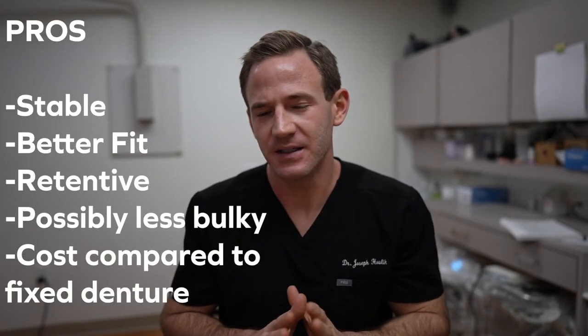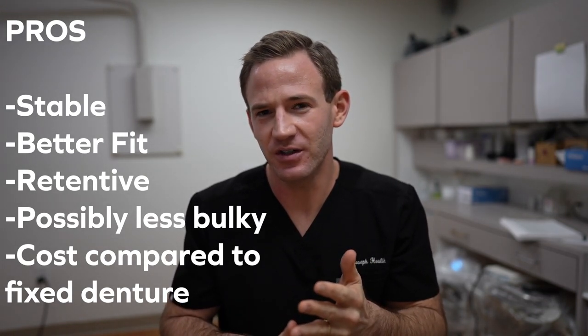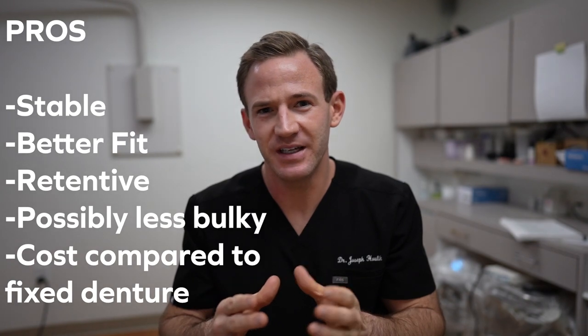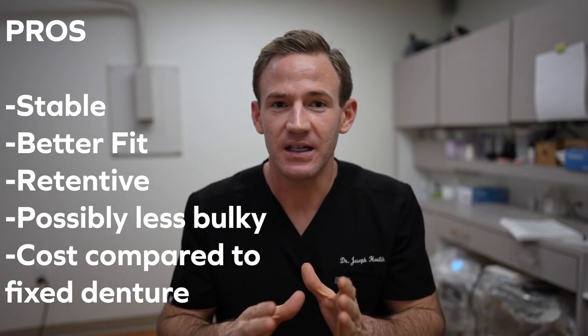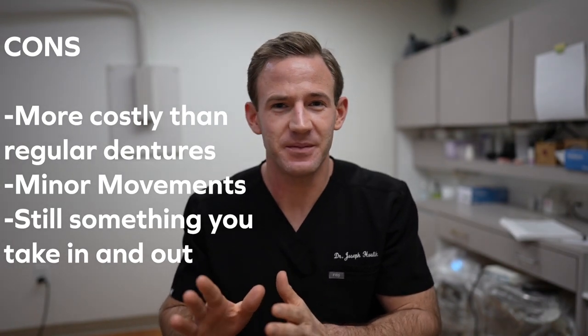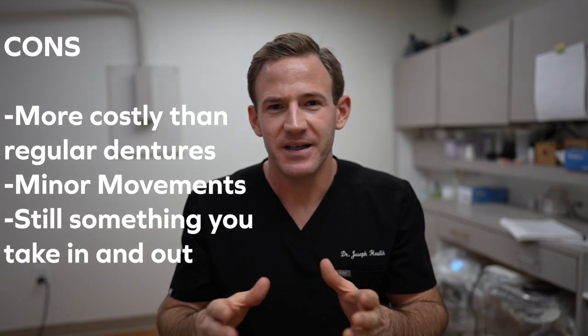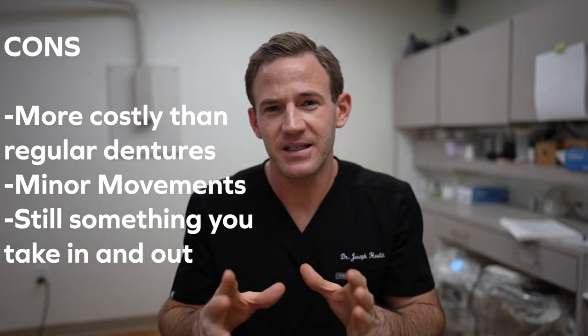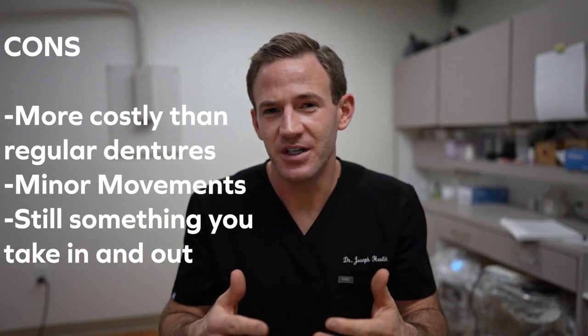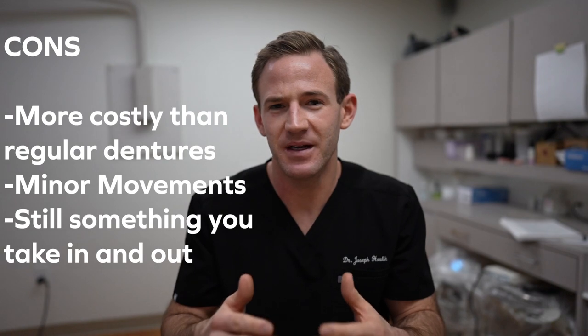As far as some pros and cons: the pros are that it's going to be a more stable, better-fitting denture that's more retentive in your mouth. Depending on how many implants we place, sometimes we can remove some of the denture material so it doesn't feel as bulky. As for the cons, cost is one — it's more expensive than a regular set of dentures, but not as costly as the fixed, non-removable option. Even with the best-placed implants, the denture might still have a little bit of movement. And you are still taking it in and out at the end of the day, so if that bothers you, this may not be the best solution. Overall, I've found it to be a great cost-effective way to give patients stability and confidence in their day-to-day life.